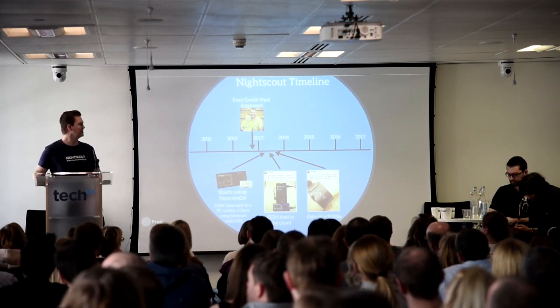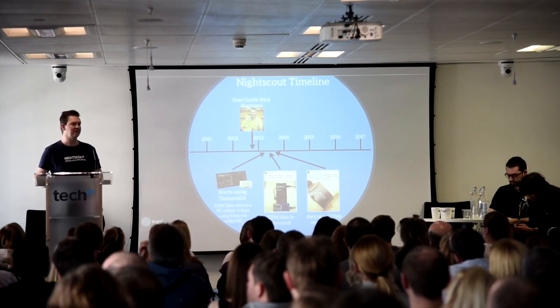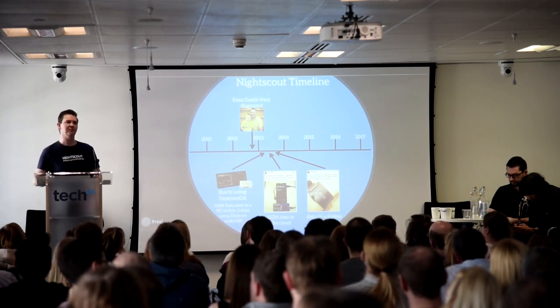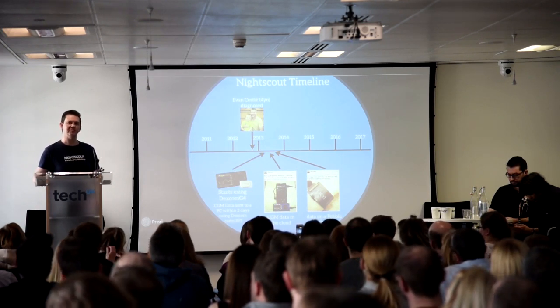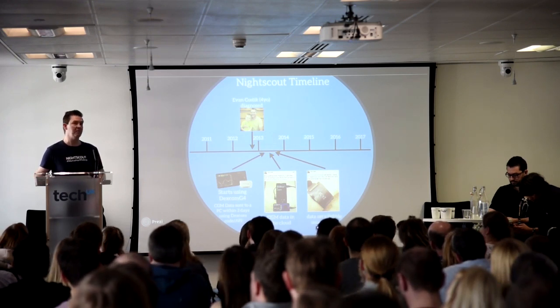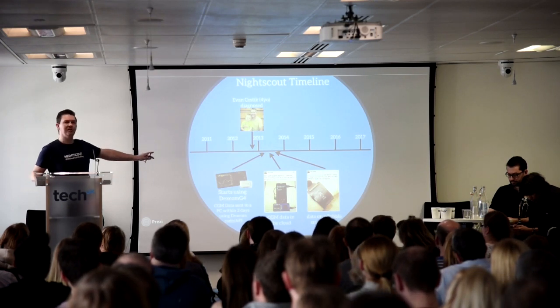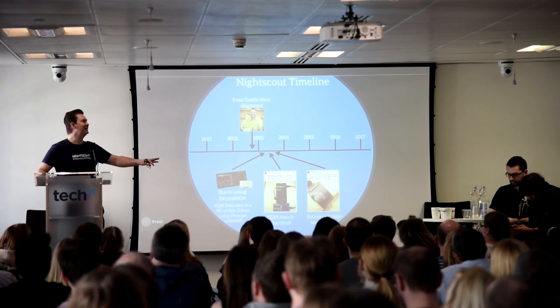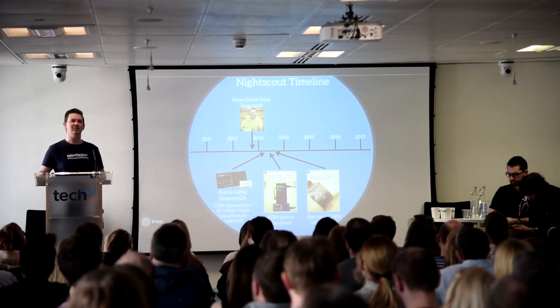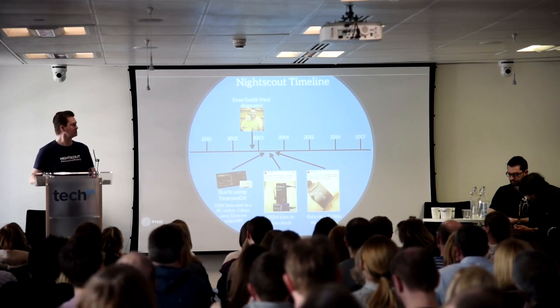A few months later, John was using a new startup smartwatch called a Pebble. I dare say a few of us have got these in the room. The Pebble was quite a new startup, and it was one of the things that we could program. So John wrote a program to download that data, and he got the glucose values on his watch. So immediately that closed the loop there, I shouldn't use the word loop. We got to the point of what he wanted to do at that point, which was to see his child's glucose values on his wrist.